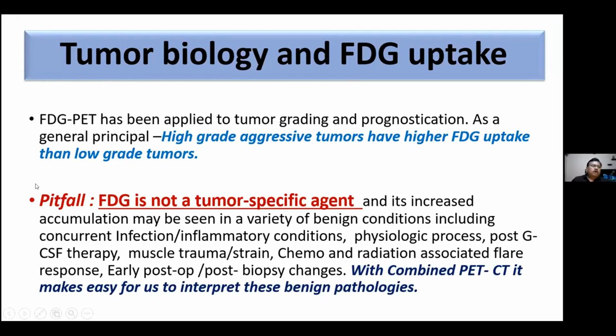Now, I want to talk about a unique pitfall, because this pitfall is important, and I know most of my oncology colleagues know this pitfall. Just to emphasize on this pitfall, FDG is not a tumor-specific agent. Unlike PSMA or unlike MIBG, this is not a tumor-specific agent.